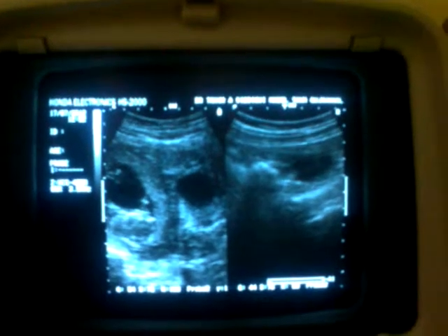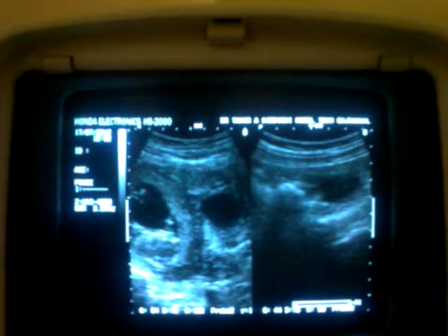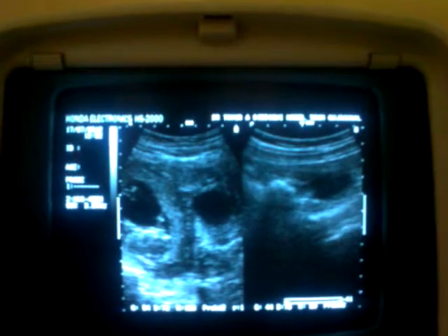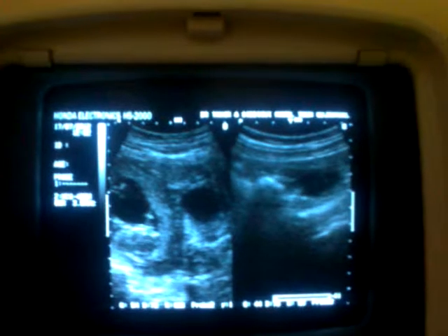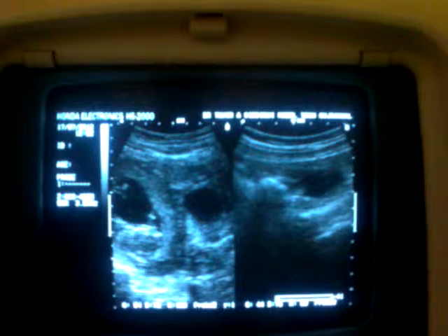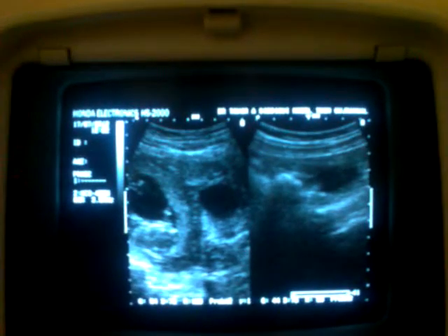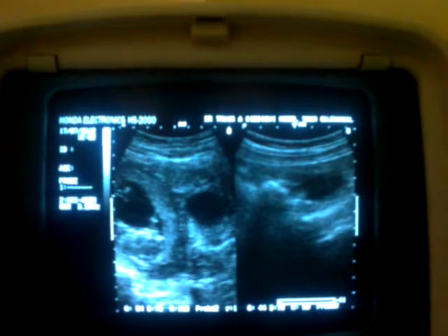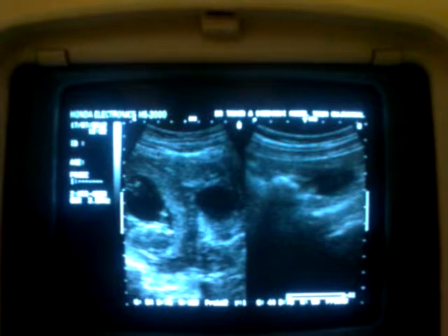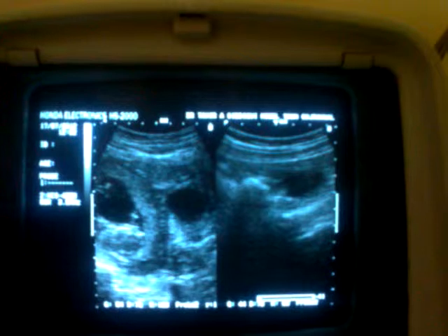So this is a very interesting case, a difficult case, and the uterus has a single cervix and vagina. So this is a case of ruptured ectopic pregnancy with a subseptate uterus having an intact 13 weeks pregnancy in one horn, and in the second horn there is a gestational sac that is empty, suggestive of either a missed abortion.